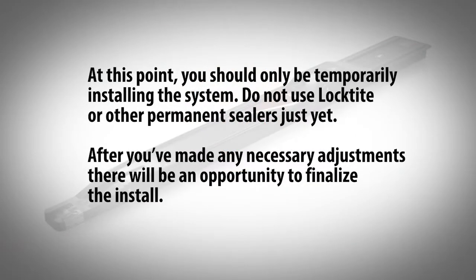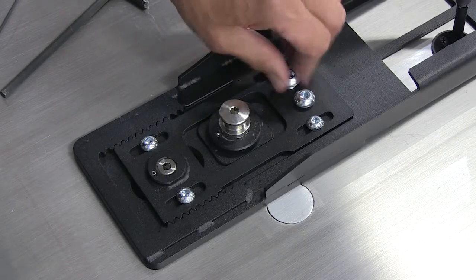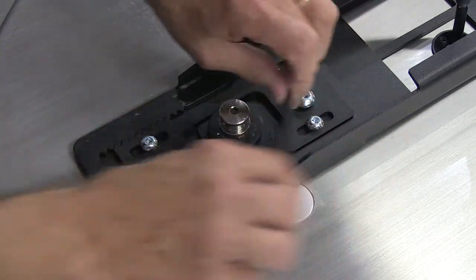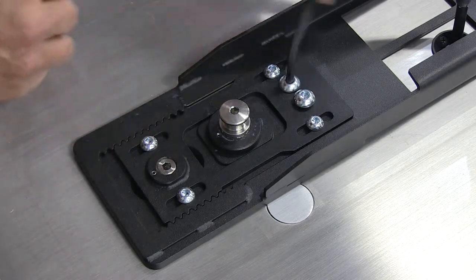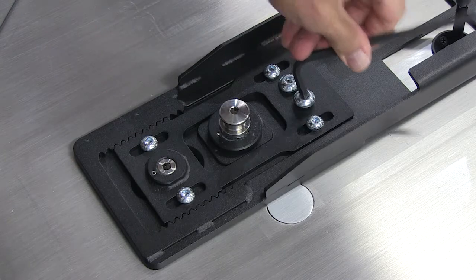At this point, you should only be temporarily installing the system. Do not use Loctite or other permanent sealers just yet. After you've made any necessary adjustments, there will be an opportunity to finalize the install. When the mounting rail is properly seated, use a 6 mm Allen wrench to install the two holding screws into the adjustable plate at the end of the rail. If the screws do not completely install tight against the plate, the mounting rail is not properly seated.